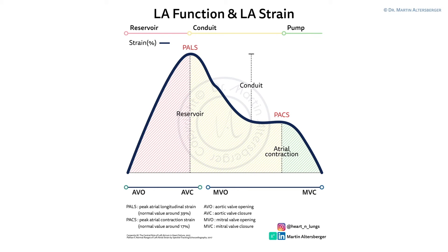Continuing with strain imaging, we can also evaluate left atrial strain. To understand this, we need to appreciate the three phases of the left atrium: the reservoir function, the conduit function, and the pump function. The cardiac cycle is displayed at the bottom of the image, showing the aortic valve opening (AVO), aortic valve closure (AVC), mitral valve opening, and mitral valve closure. There are two key measurements: PALS — peak atrial longitudinal strain — with a normal value around 39%, which is a positive value, and PACS with a normal value of 17%.